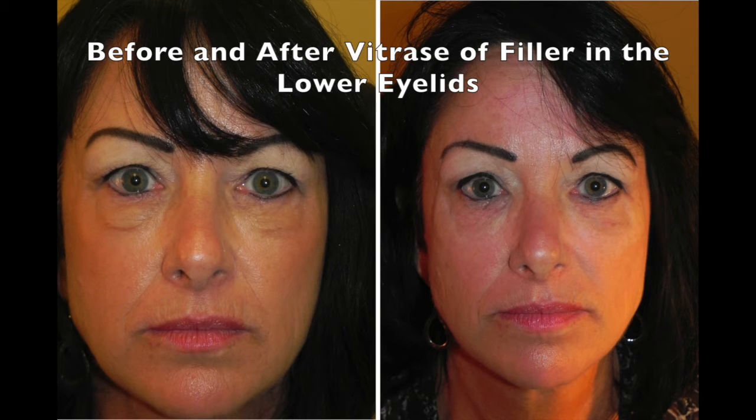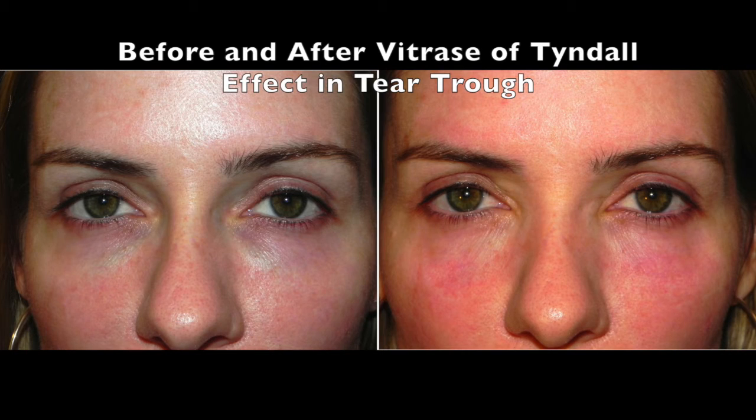Thankfully, the fillers put in the lower eyelids here were hyaluronic acids, and I was able to dissolve them with hyaluronidase. This patient had fillers put in her tear trough years before and was really disturbed by the blue cast that was shown through the skin, otherwise known as the Tyndall effect, and she responded beautifully to hyaluronidase treatment of these tear trough fillers.